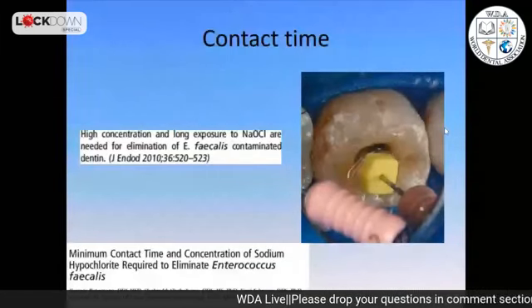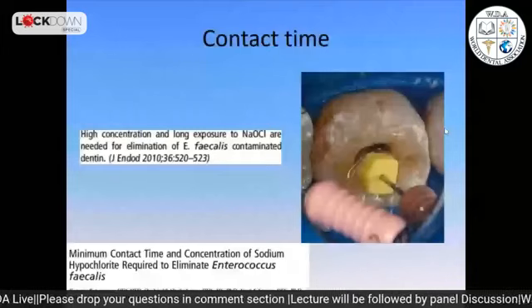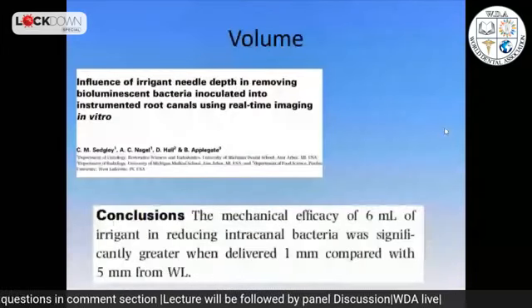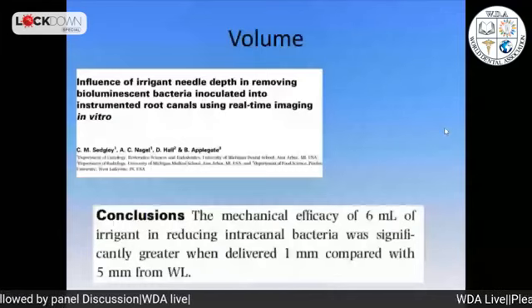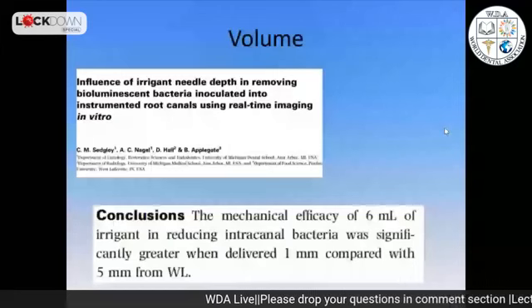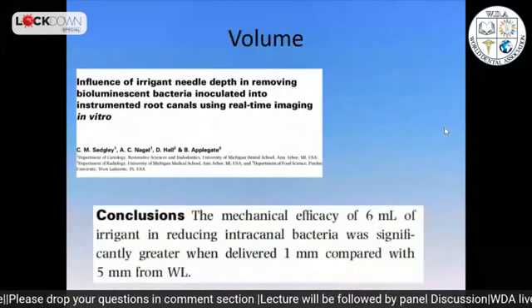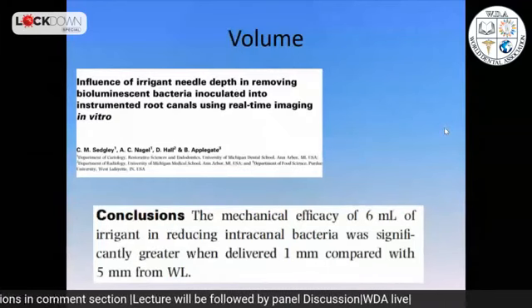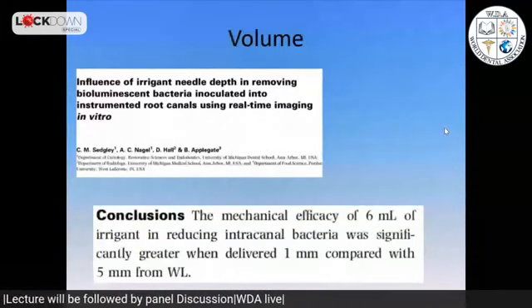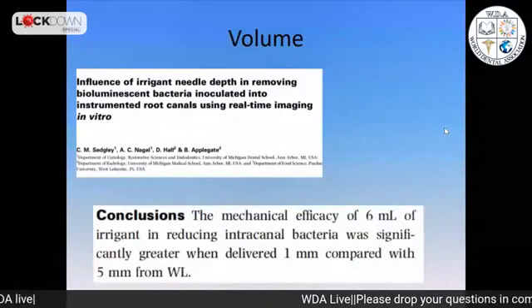Volume. We tend not to use a lot of irrigant. We sometimes use just one syringe, two syringes. There is good evidence that the more we use, the better the antimicrobial efficacy. So this is a form of agitation because we use a large volume. The more liquid we use, the larger amount of debris will be removed. This is an important action.